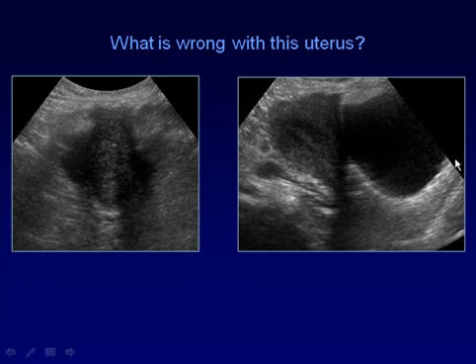In the sagittal view, you have vagina, cervix, somewhat elongated, the bladder, and this is where the adhesion is. And no matter how big the bladder would get, it would just keep pushing up at the uterus and never cover the uterus to provide a sonographic window.